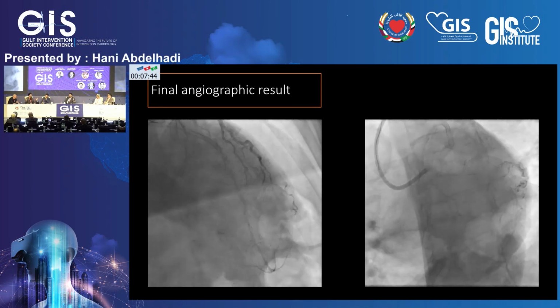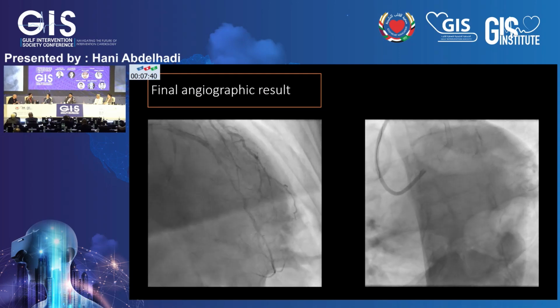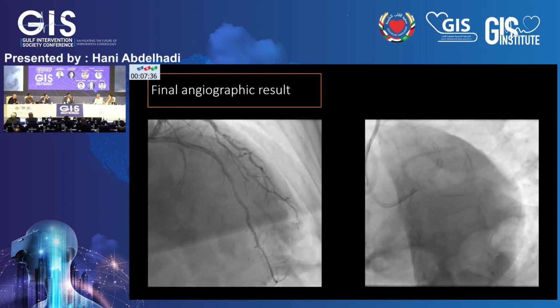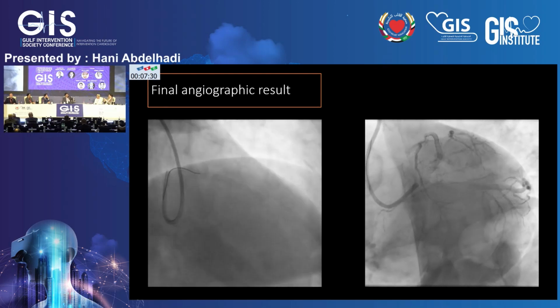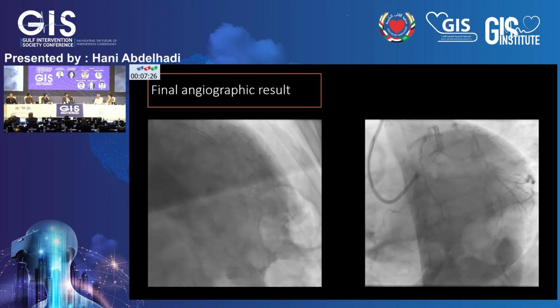If you have multiple dissections, which we leave in CTO all the time now, as long as there's flow, the artery will maintain patency. That's an important point, because I find flow is a key metric to watch, because if there is very good flow down the artery, even though there is a dissection and so on, such lesions are safer to leave compared with others.